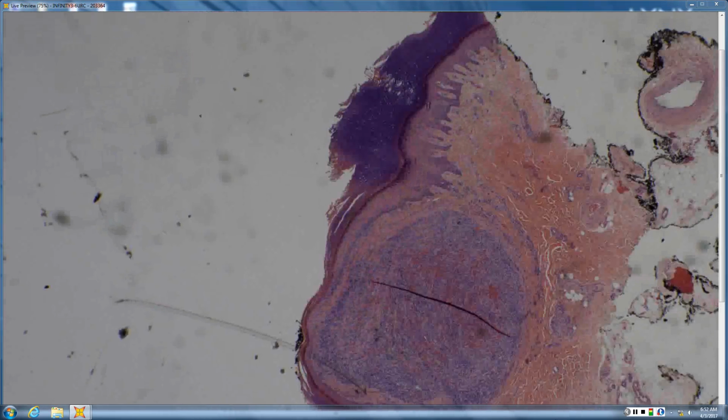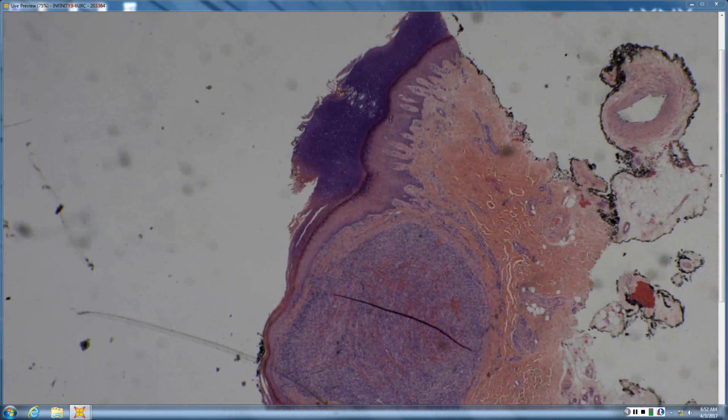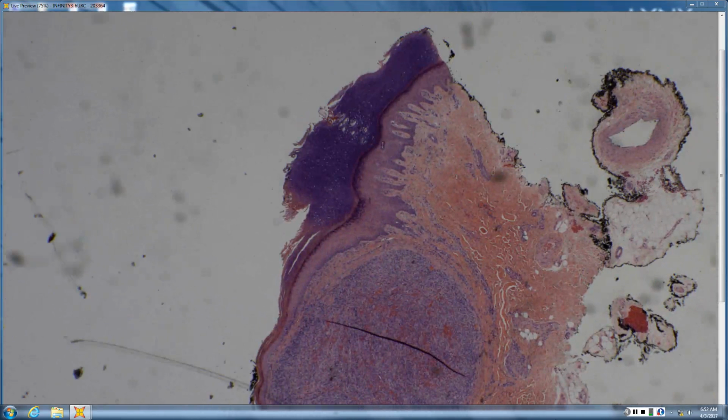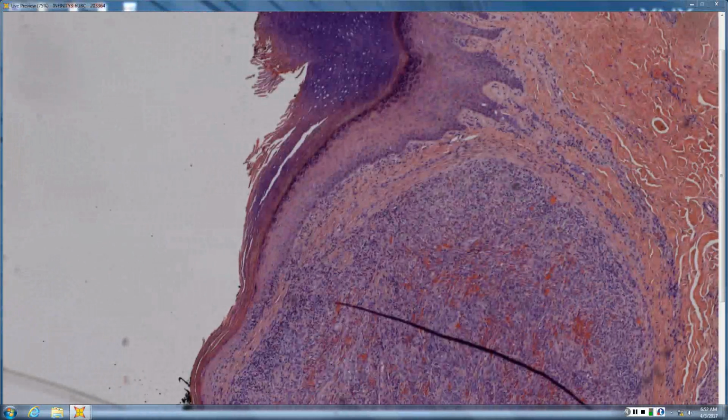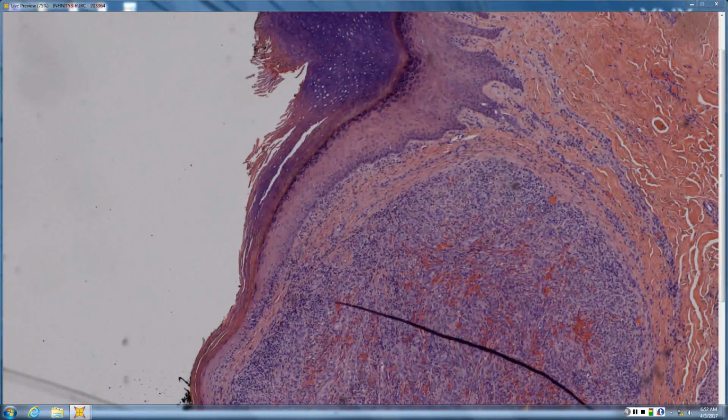Okay, jumping straight from that into number 2, which is nodular Kaposi's, probably on the palm or somewhere acral, maybe on the foot. And from scan here, this one, you got this kind of ball of spindly, vascular-looking tissue there in the dermis. And, from scan, you can hopefully get to it's certainly something neoplastic in a sense. It's something that's proliferating. It has all this hemorrhagic blood throughout. And so that makes you think of something vascular.